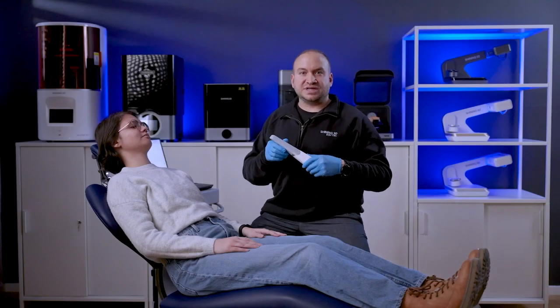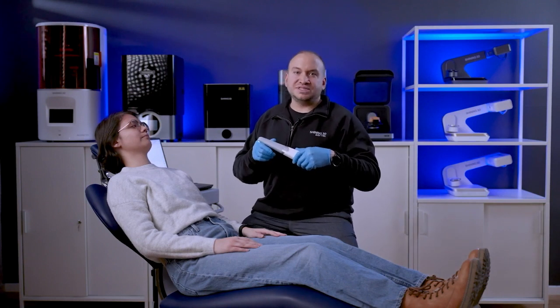Pressing the button on the scanner body, we can start the scan phase. Look how easy and smooth the scan process is.